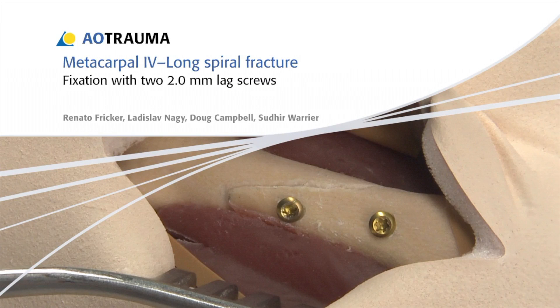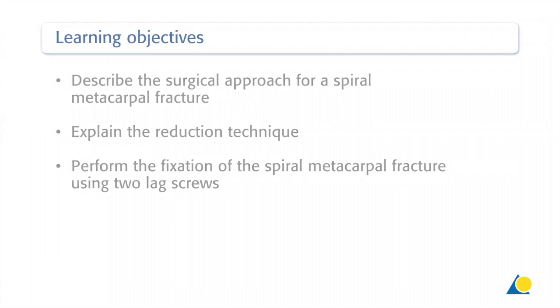In this presentation, the fixation of a long spiral metacarpal fracture will be demonstrated using two 2.0 mm lag screws. Upon completion of this exercise, you should be able to describe the surgical approach for a spiral metacarpal fracture, explain the reduction technique, and perform the fixation of the spiral metacarpal fracture using two lag screws.